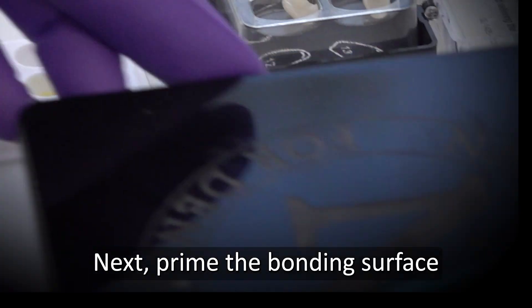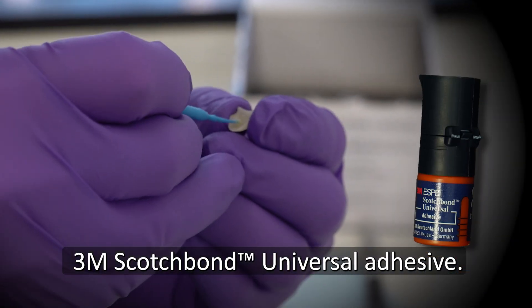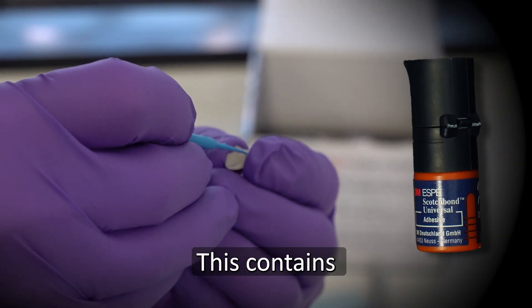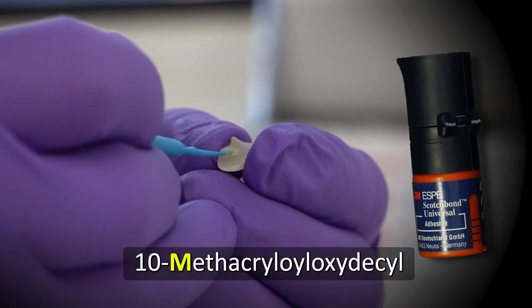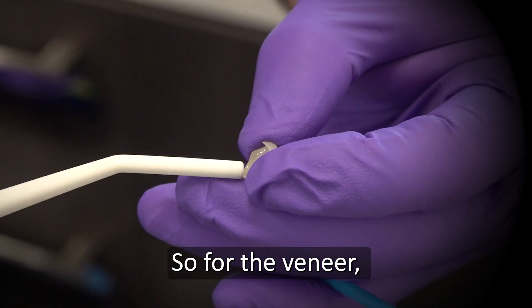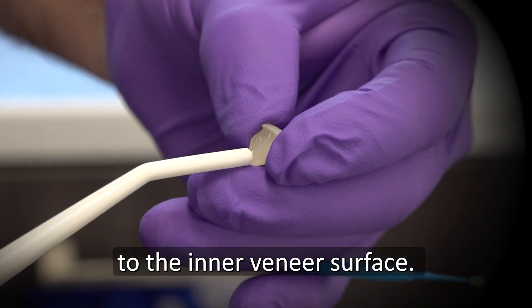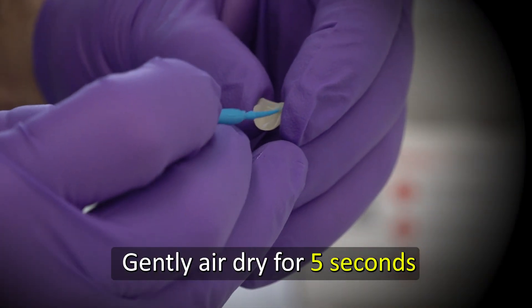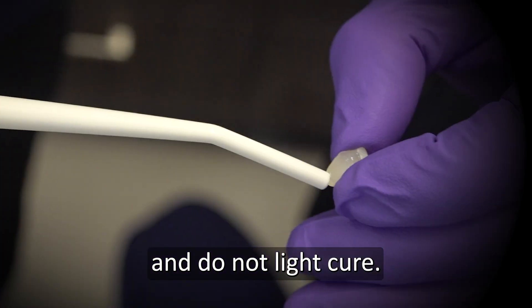Next, prime the bonding surface with your favorite zirconia bonding agent like 3M Scotch Bond Universal Adhesive. This contains the key ingredient 10-methacryloyloxydecyl dihydrogen phosphate, also known as MDP. For the veneer, apply Scotch Bond Universal Adhesive to the inner veneer surface. Gently air dry for 5 seconds to evaporate the solvent, and do not light cure.